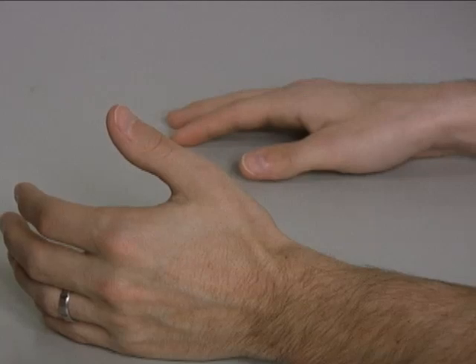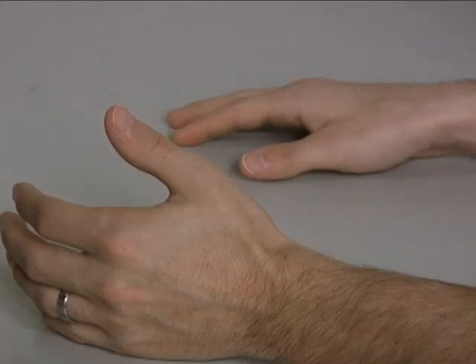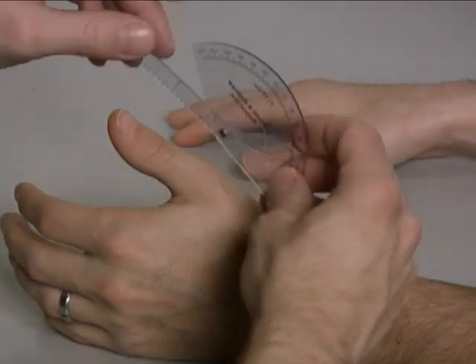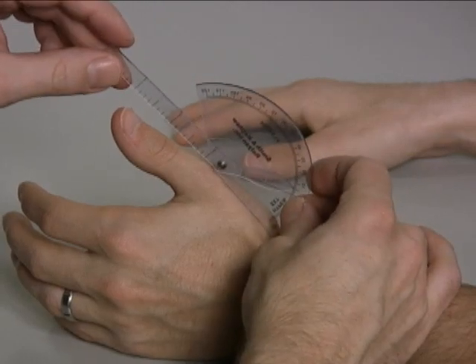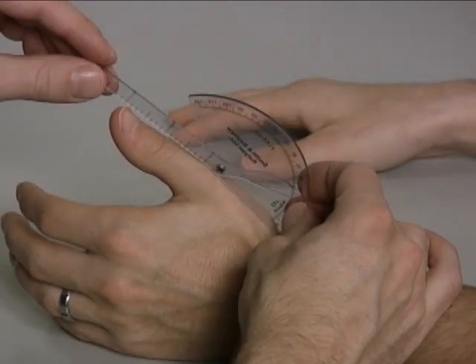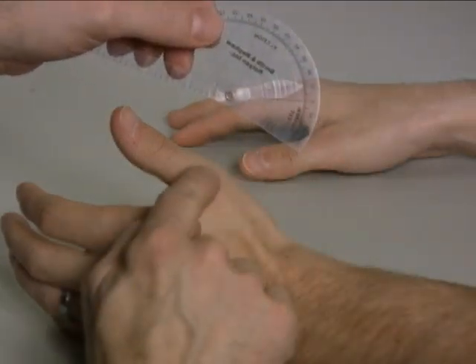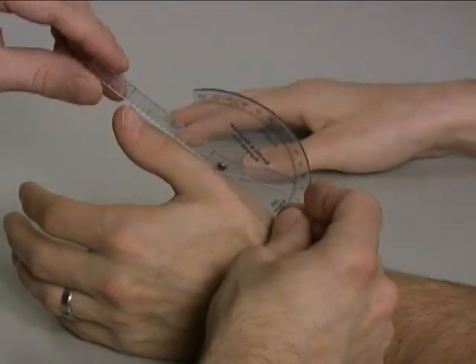To measure thumb metacarpophalangeal joint extension to flexion, the patient is seated at the table with hand on the table. You will place the goniometer on edge on the back of the thumb with the axis of the goniometer centered over the metacarpophalangeal joint.